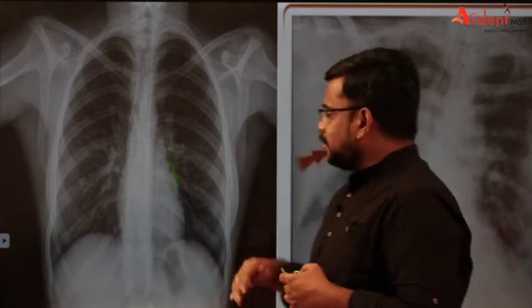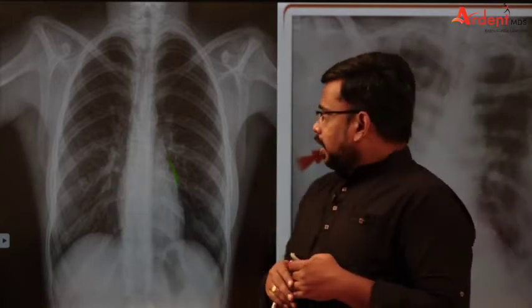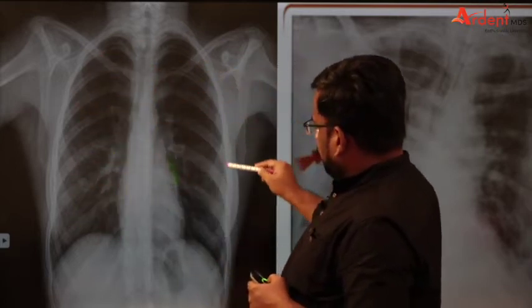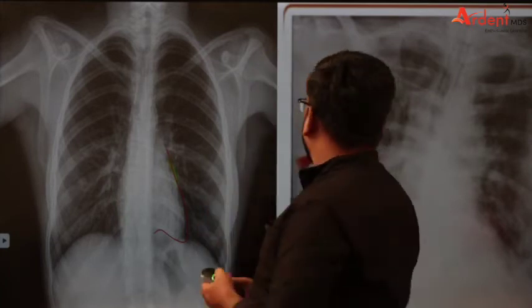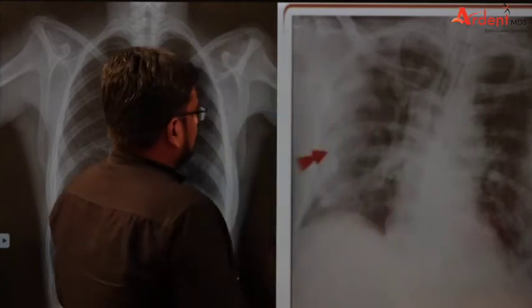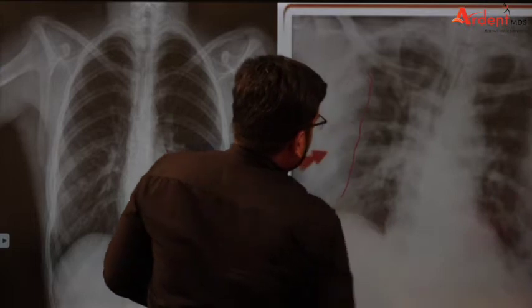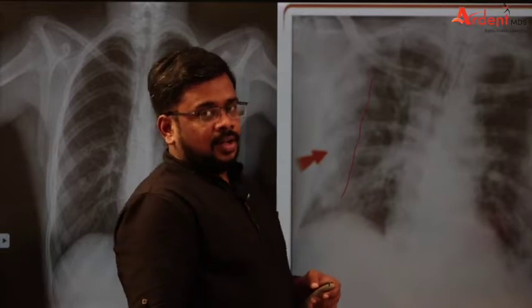This is a normal X-ray, and this is a COVID-19 patient's chest X-ray. If you see the normal X-ray, the periphery looks very normal. Coming to the COVID-19 patient's chest X-ray, you can see opacities in the periphery. This is ground glass appearance plus consolidation, which is suggestive of COVID-19. This ground glass appearance in a COVID-19 patient is generally bilateral — initially unilateral but becomes bilateral and multifocal.